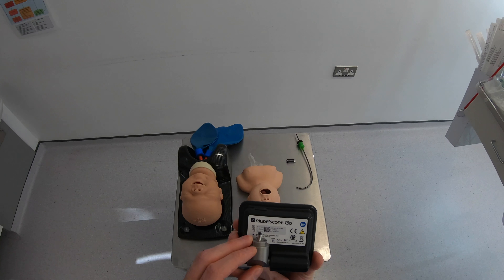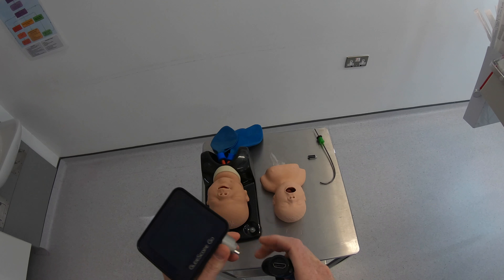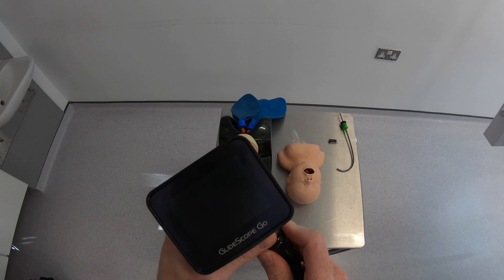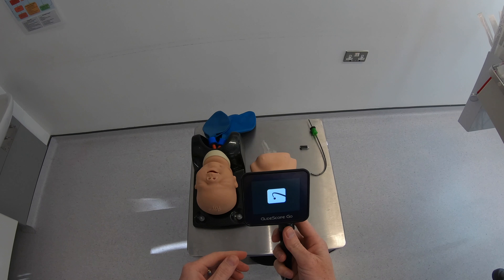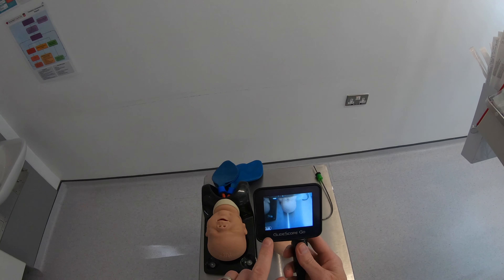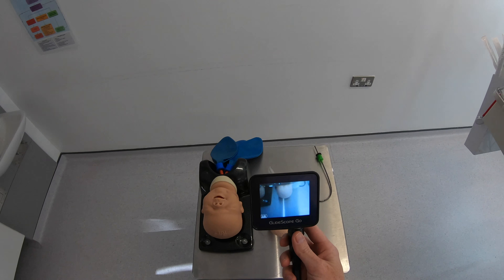It plugs in just to the same place you would plug your smart cable. It's obviously quite a small compact device — this bit just folds back down and we'll plug it in. Hold the power button to turn it on and you've got a relatively quick power up.